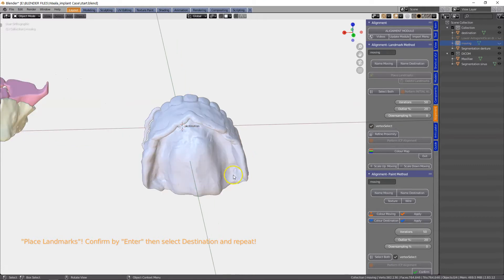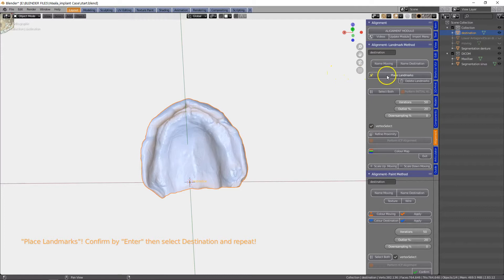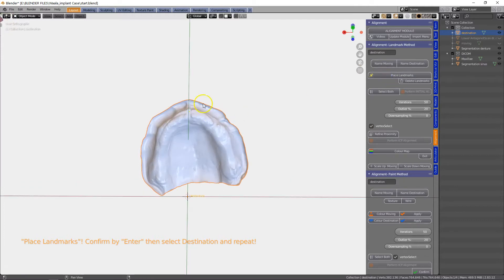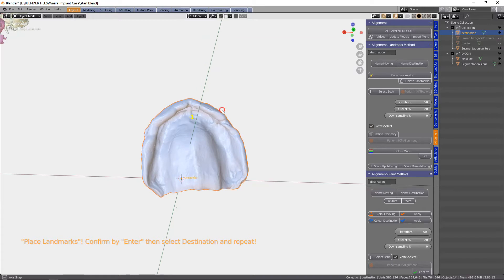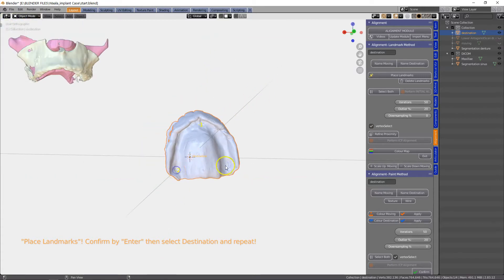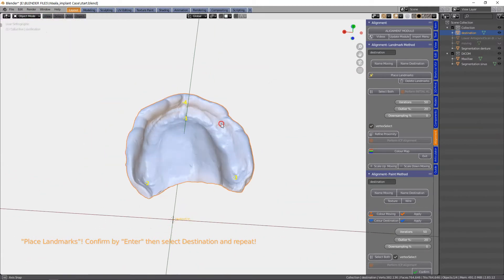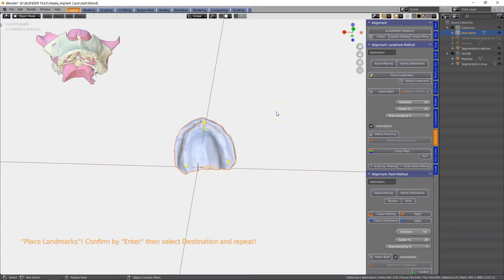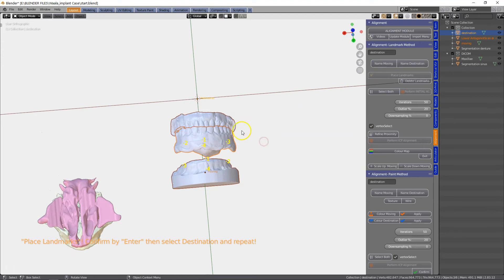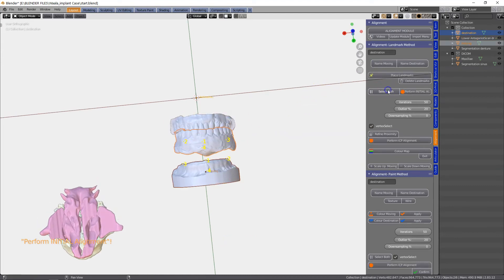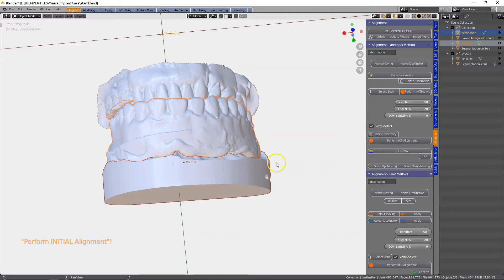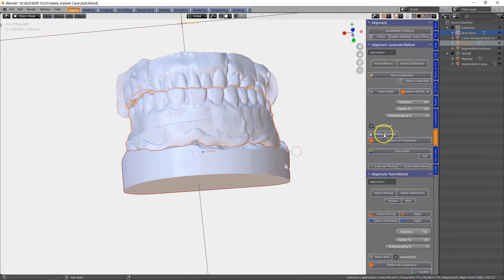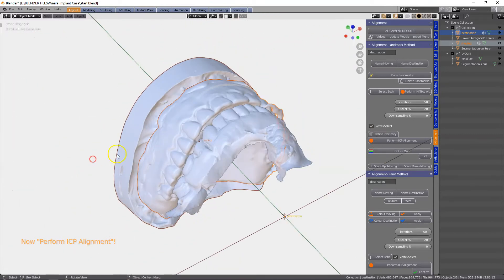Problem is I can't see what I'm doing, so I'm going to hide that. Place landmarks — and of course we need the order of our placement. I think it was one, two, three, four. Let us try that. Enter. Alt H to unhide. We're going to then select both of these.